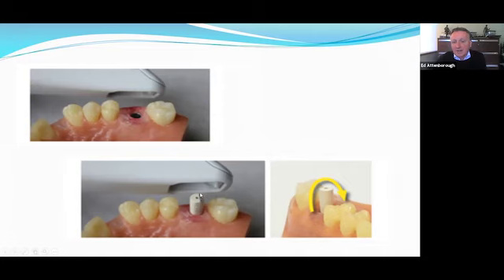And then the software compares that shape from the scan to a library of shapes that it holds for scan bodies or abutments. And it can then extrapolate back to the accurate position of the fixture head from a scan of the top of the scan body. So that's typically the process for implant work.